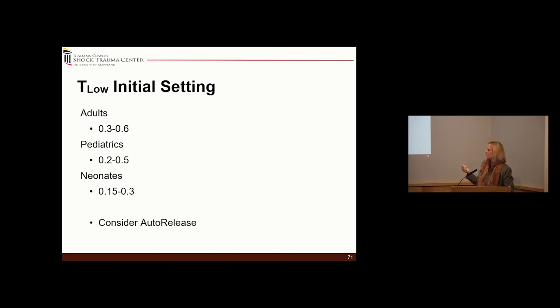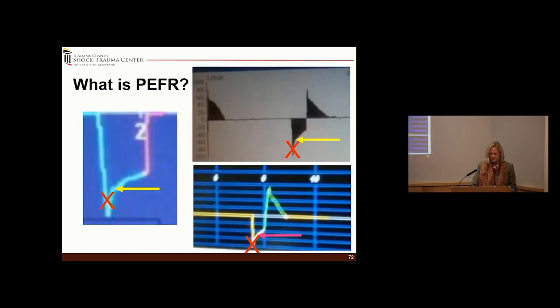So we're anxious to work with them on that. The other thing is, remember, some ventilators have, and it sounds crazy, but 0.3 seconds to 0.4 seconds can be like this, okay? So if you want 0.32 and not 0.3 and not 0.4, you might not be able to get it on some of the older ventilators.